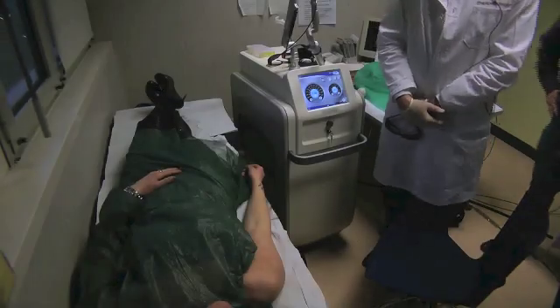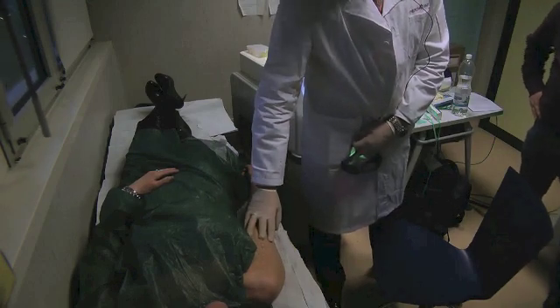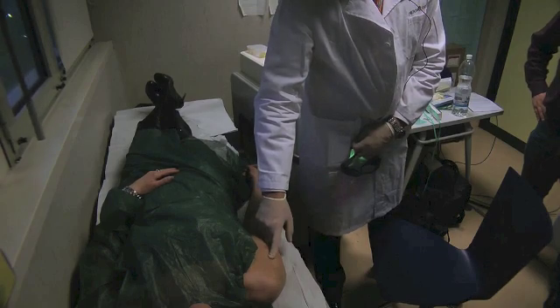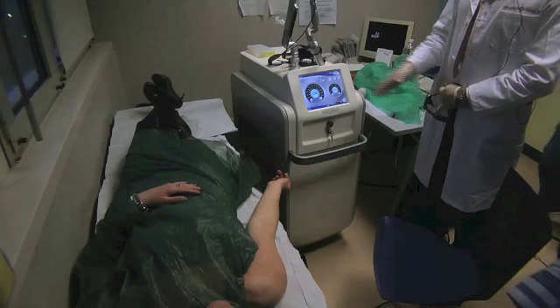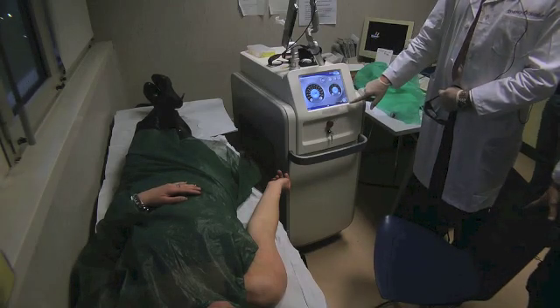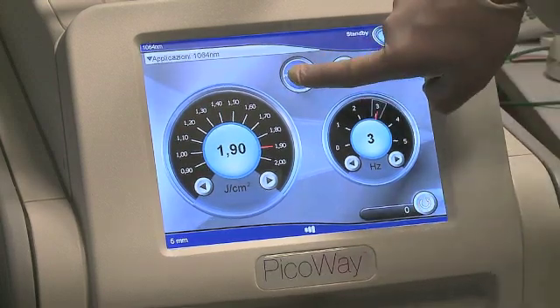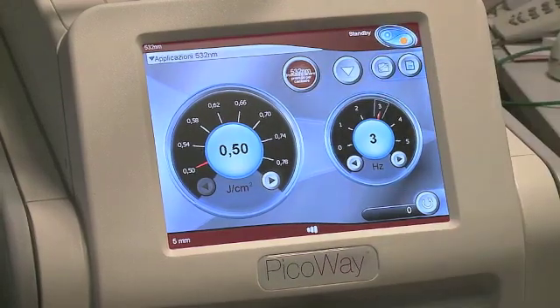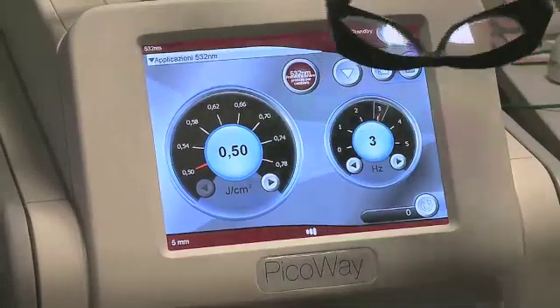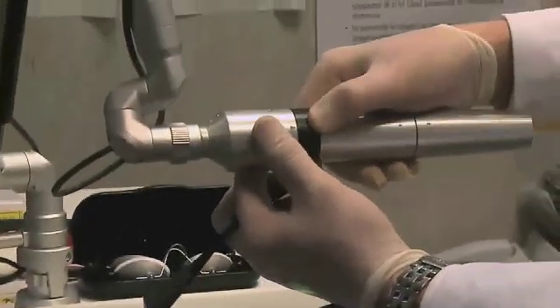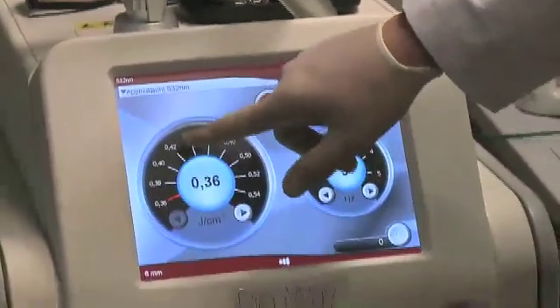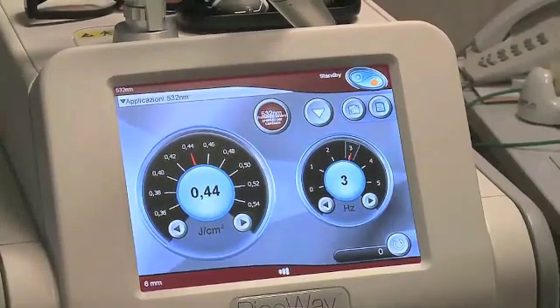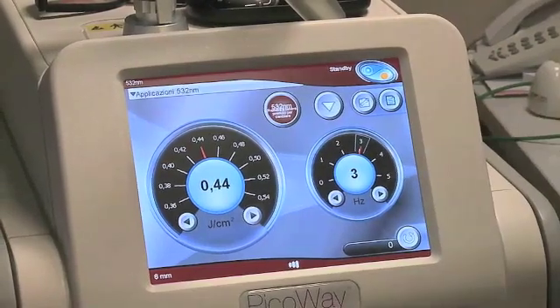We have here a young lady with a Becker nevus, and we want to treat now with the same system but with the KTP wavelength. These are the settings we used on the last patient, so we reset and change the wavelength. Now it's 532 nanometer. We go to a different spot size — it has been 5 mm, now 6 mm — to go a little bit deeper. We switch to a fluence of 0.44 joule per square centimeter, keeping the same repetition rate.